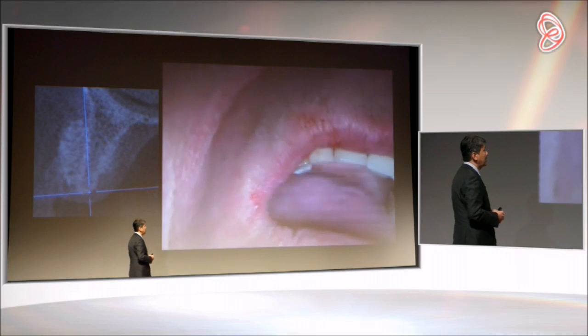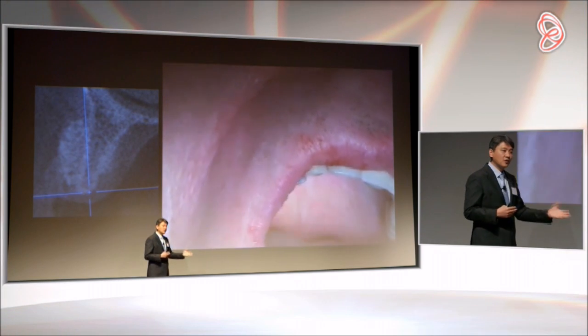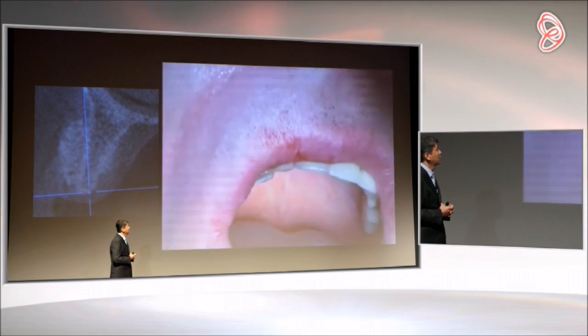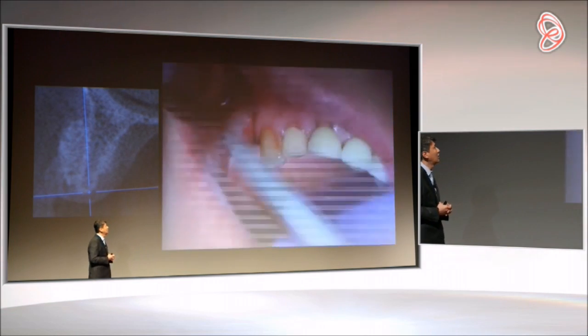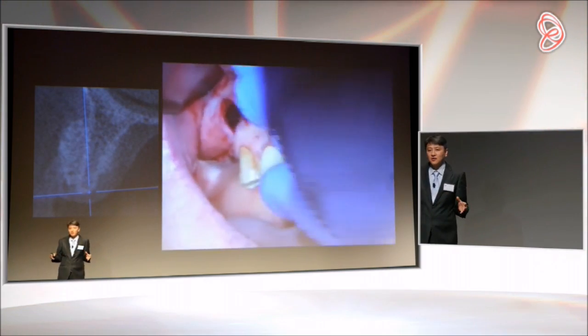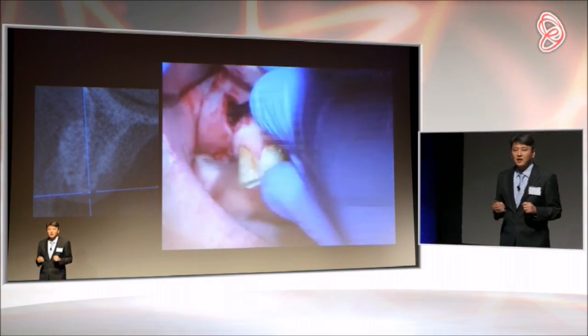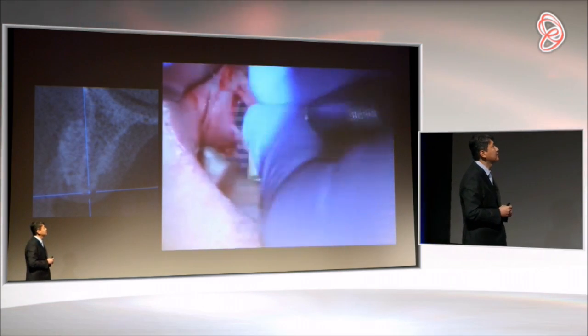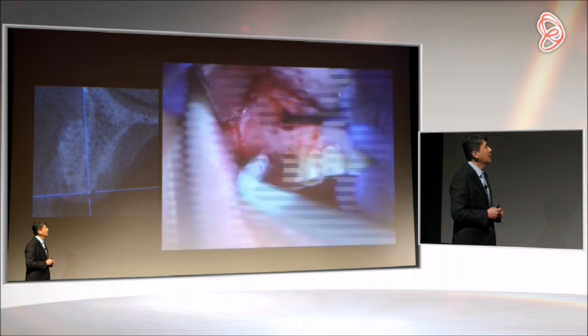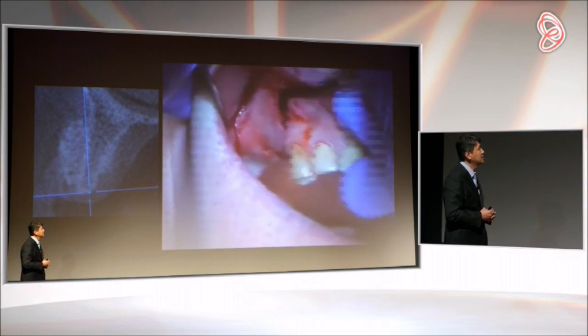And we will use the back action chisel to remove any residual periosteum. And we will introduce collagen membrane, which will act as a tunnel for us to introduce bone graft material. So here, we are just decorticating and relaxing the flap internally.